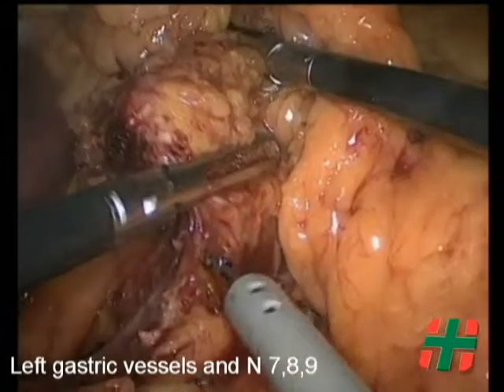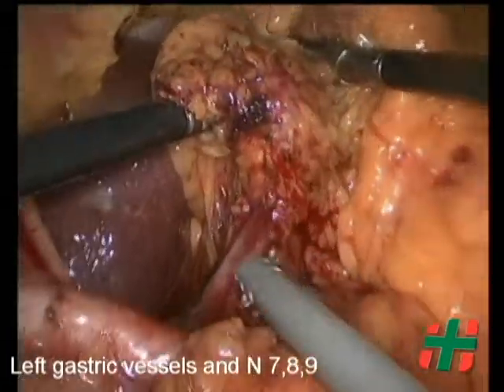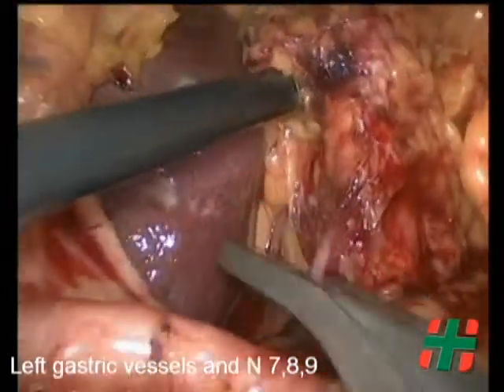Left gastric vessels are carefully dissected and divided using polymeric vascular clips. All lymphoglandular tissue around them, including groups number 7 and 9, is dissected.